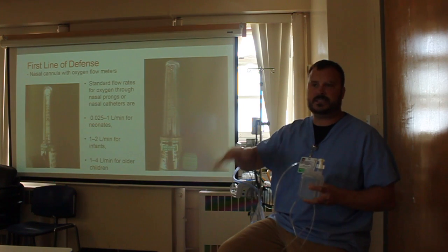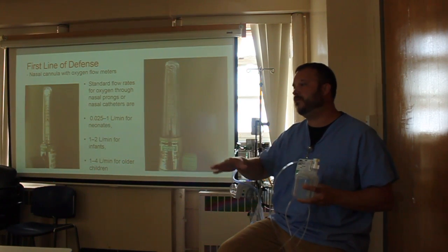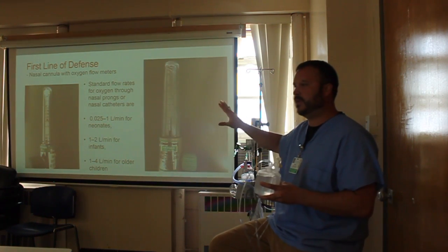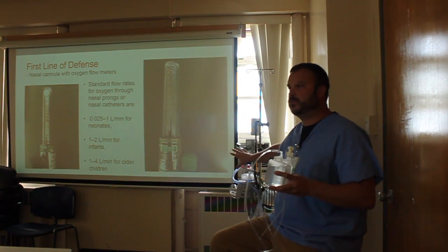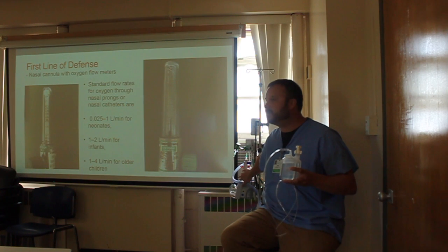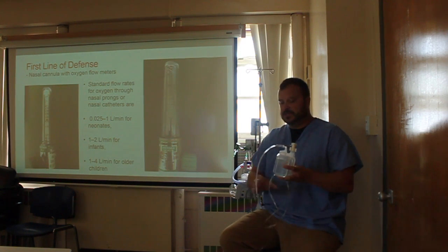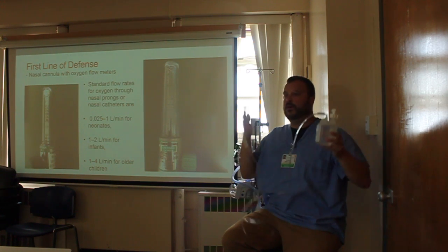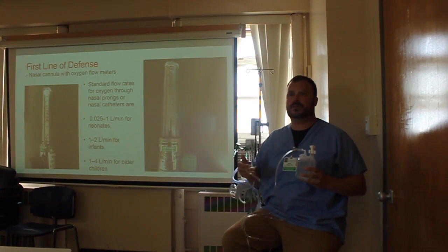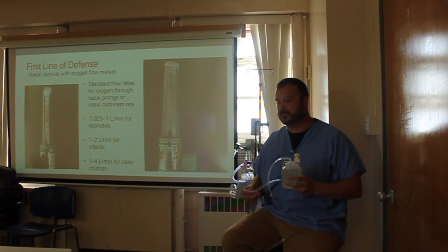And I'm not saying it needs to be heated and humidified. We're about to get into some calculations here that'll explain that a little further. If that were the case, then we're going to something like this, which has a built-in heater on it, right? So, nasal cannula, coming through a little bubble bottle. Hopefully we don't dry out the nose. We don't want bloody noses, right? We don't want the patient to be uncomfortable.